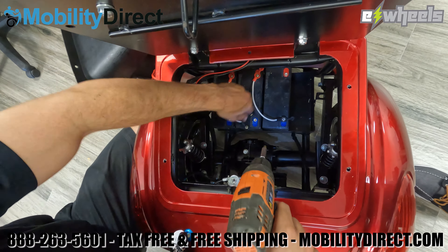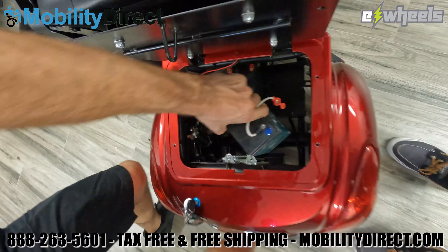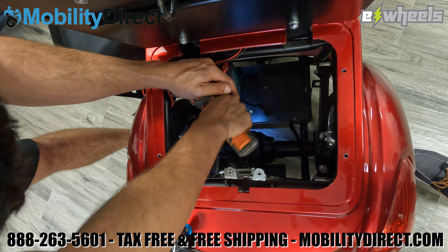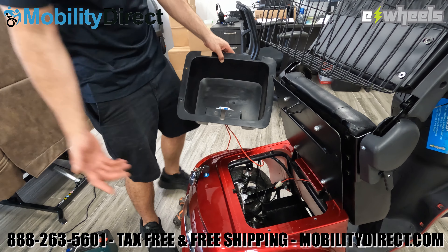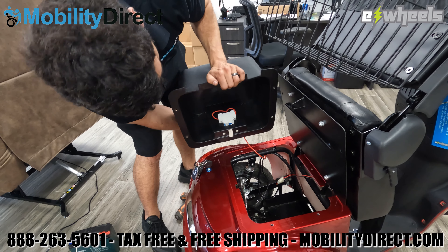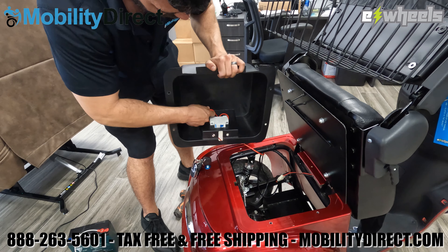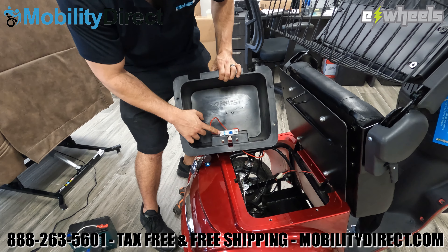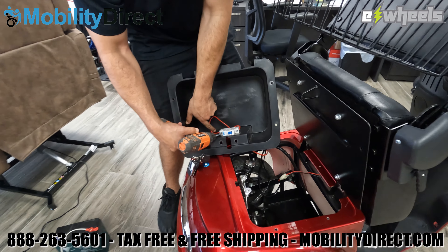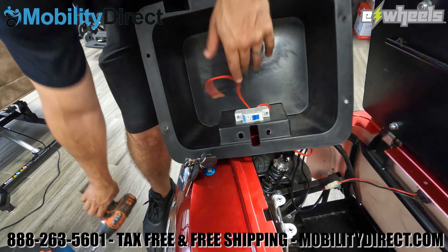You should also turn off the circuit breaker before doing this, which is in the storage compartment. There's a little blue switch — if you turn that off you're going to prevent any short circuits from happening. Once you have the battery compartment out, you're going to notice one of the red wires is still connected to that breaker switch. Find which wire is plugged into the left side of that circuit breaker switch and remove it. Just use a Phillips head screwdriver or drill bit and unscrew it counterclockwise — that will let the wire fish right out. Now you have the storage compartment completely free.